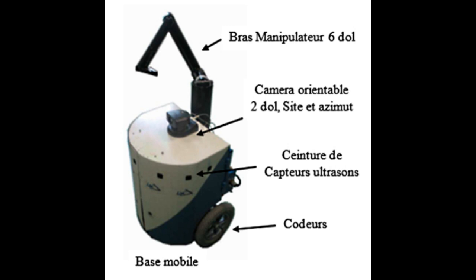Assisted teleoperation: the user controls the robot with assistance. Assisted autonomy: the robot performs tasks with user assistance. With pure autonomy, the robot performs the task on its own without assistance.